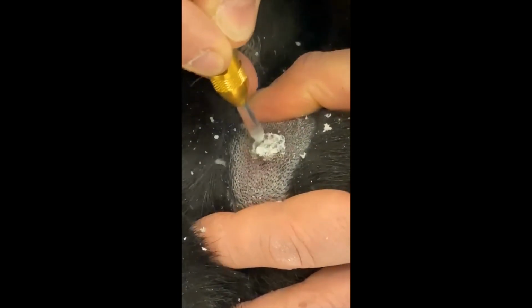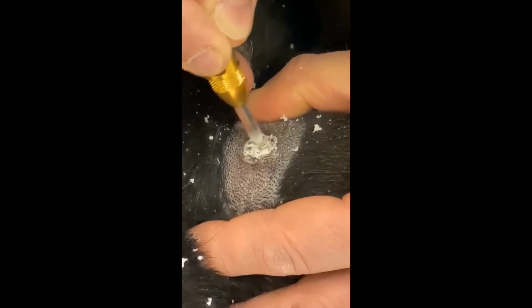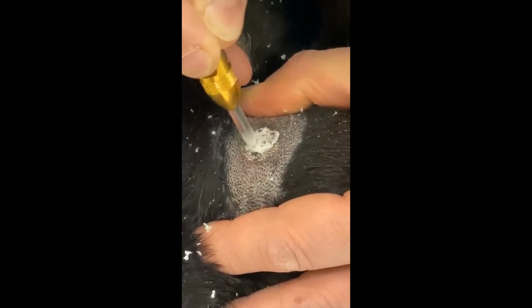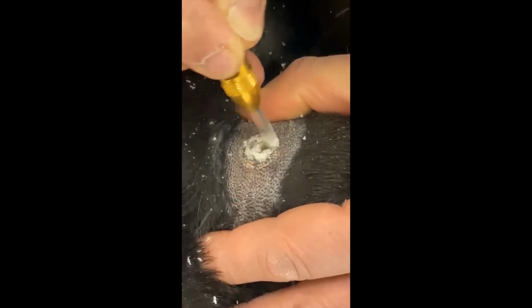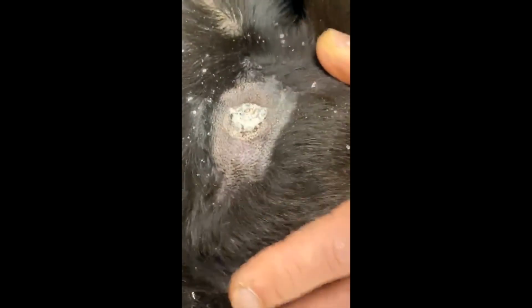Secondly, what I find is that this freezes a lot quicker than the other types of cryotherapies that I've used in the past, and I find it advantageous. It also is a lot more exacting than the cone approach to freezing. And I think that will be sufficient.